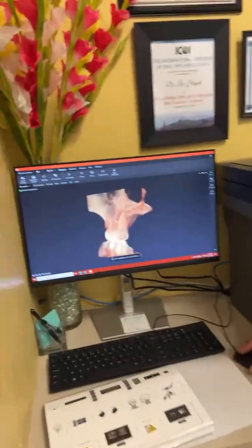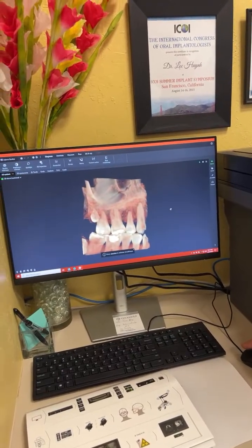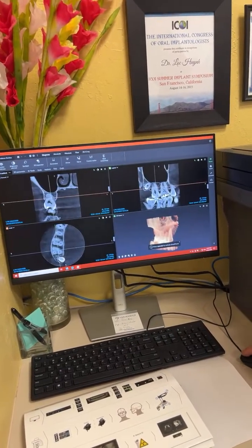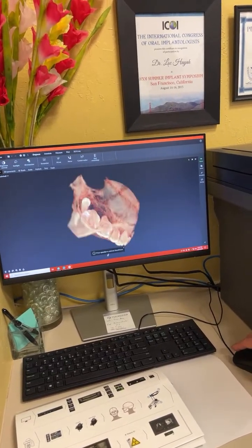Right down here is the 3D. This is the wow effect. You right click on the mouse and you can rotate it. Okay, where do you get that? Can you go back? How do you get that? It's already here. Oh, okay, there. Just double click it. And then right click and move it. And just hold and move.